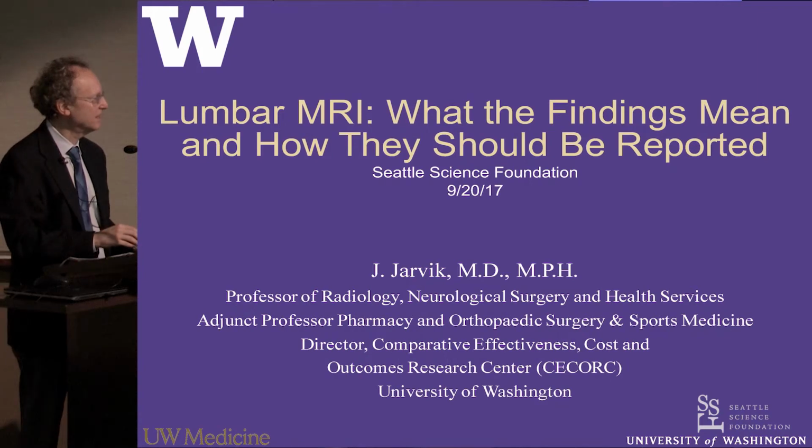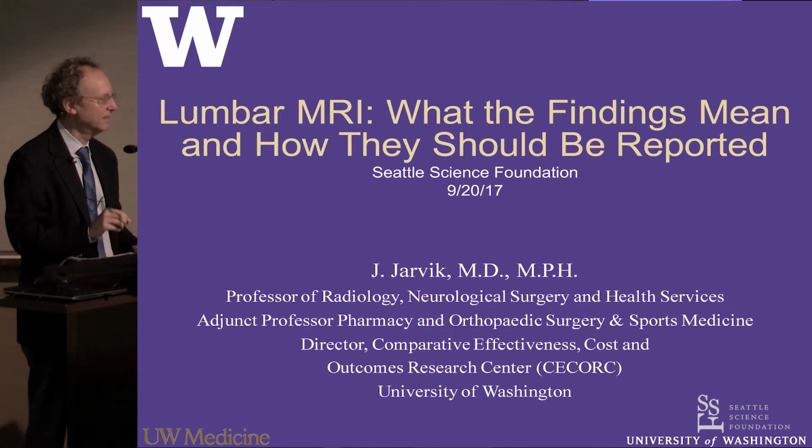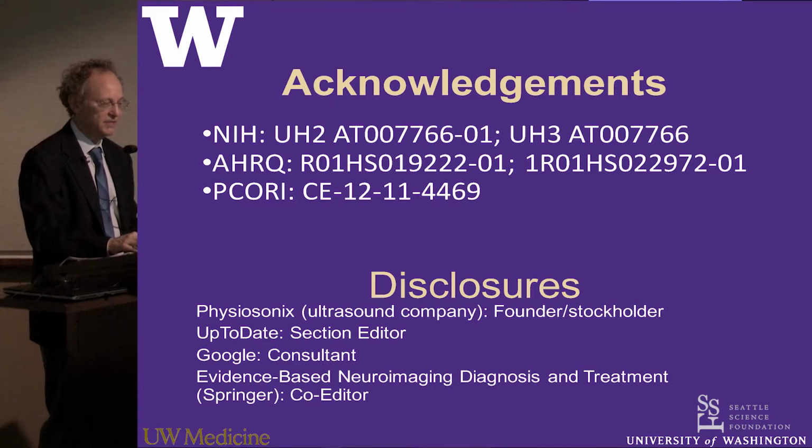In the next 20 minutes, I'm going to be talking about things that are largely review for most of you here, but there may be a couple of things that are new.